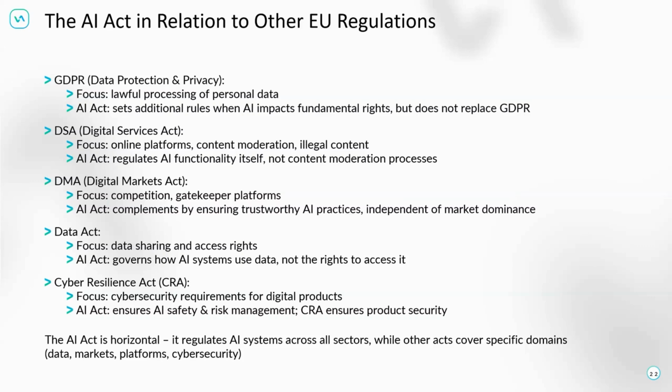So it's good for our area, because the MDR is very well described and has reached an age right now where it is usable in the market, and AI gets the addition. There is a very nice checklist already available which deals with all the points of the AI Act, and when you think about what I had in the last presentation and this one, 90% of the tasks you need to do are already covered in the quality management system of the medical device, so the AI Act relation is not that much to be done in that particular space.